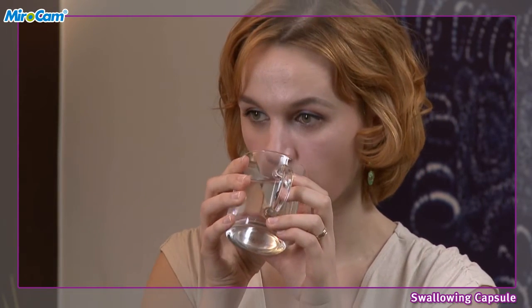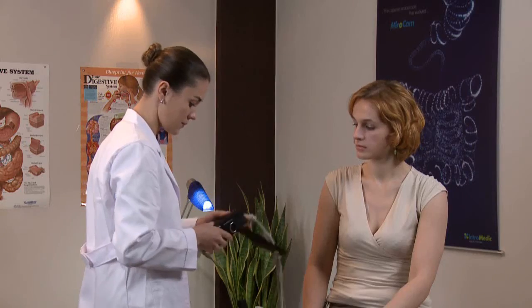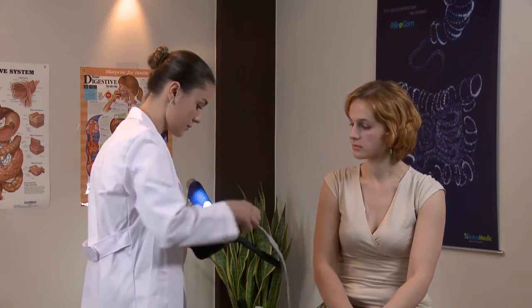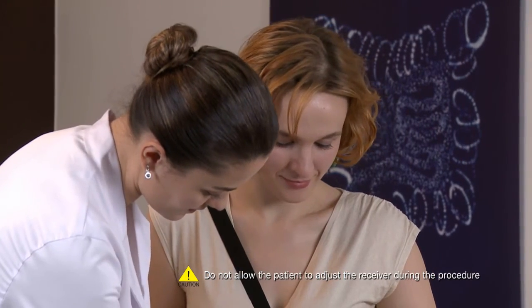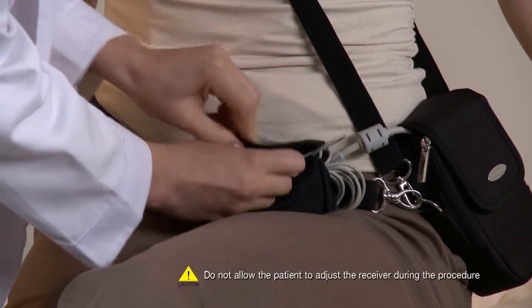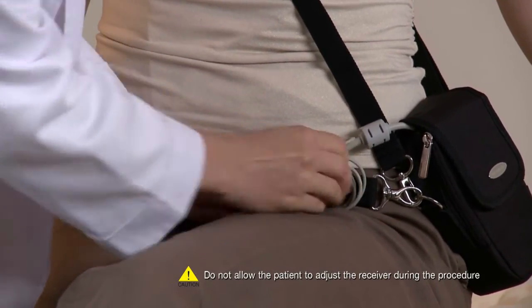Ingest the capsule with water. Place the receiver in the receiver pouch and adjust the straps to ensure the patient is comfortable. Place the excess cables in the cable bag.